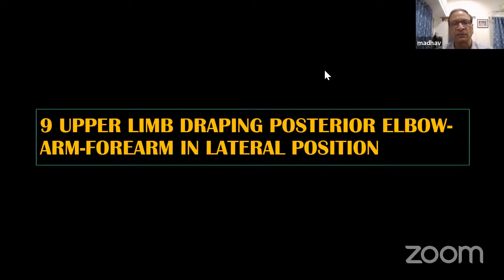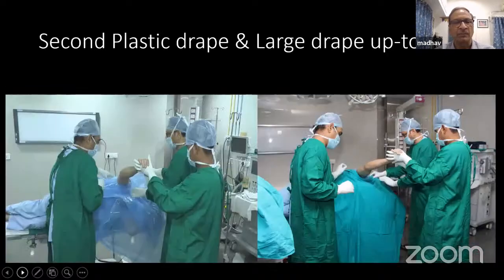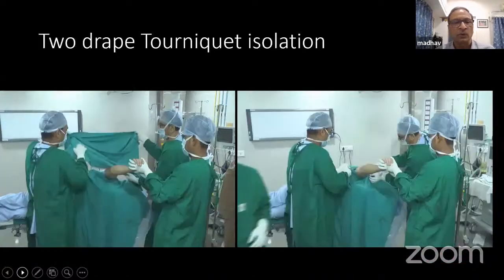So for all these surgeries, you require the patient in the lateral position with the affected side up and the arm dangling on a pillow or attachment to the table. Again, here, as you can see, this is a live volunteer, not a mannequin, because it was not possible to turn the mannequin on one side. So we have used a live volunteer. He is one of our lecturers who agreed to do it for us.